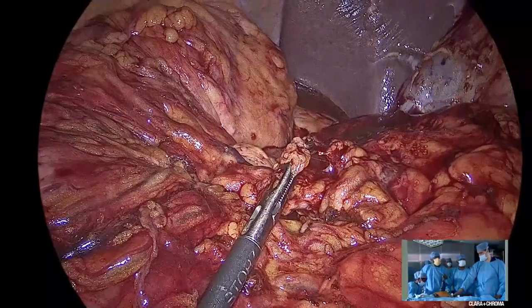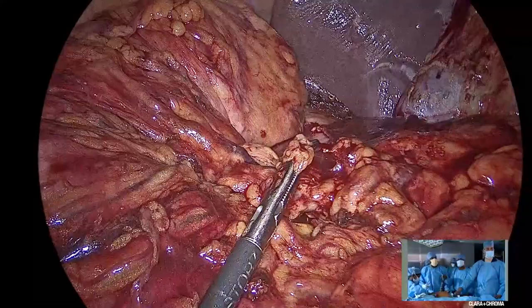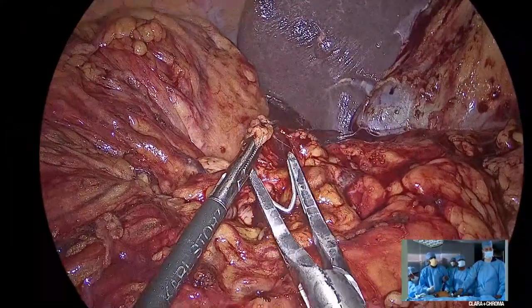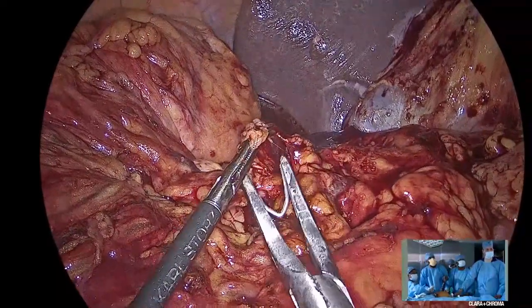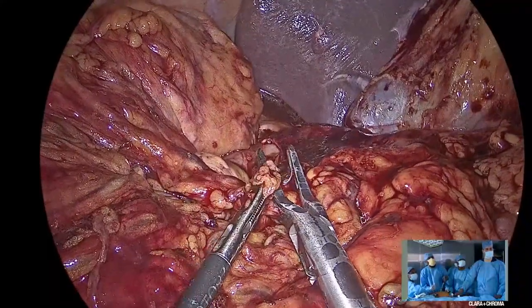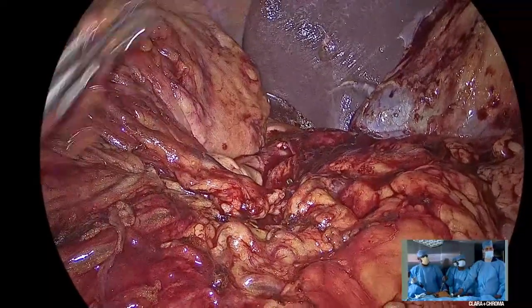This is one of the most fragile areas in the abdomen, you know. Yes, sir. I mean, at the head of the pancreas and uncinate process. The vessels are very thin-walled, they bleed easily, they are difficult to control. But you can see how Dr. Jameel is patiently and carefully holding the bleeder and clipping it. So that was wonderful. That was wonderful.